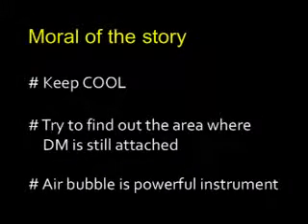Moral of the story: don't panic, keep your cool. Try to find out the area where DM is still attached. Air bubble is a powerful instrument.